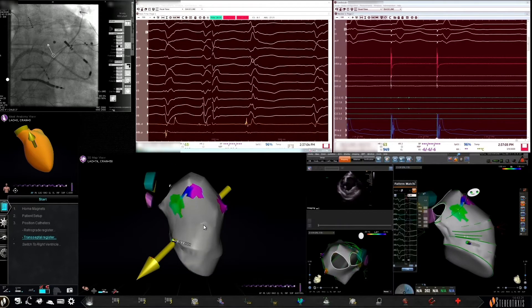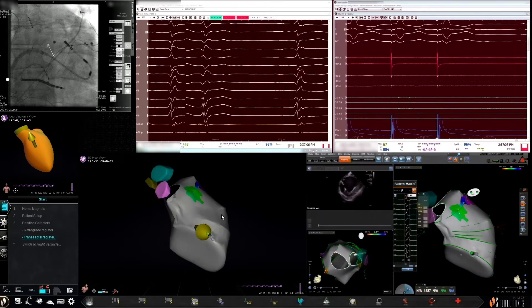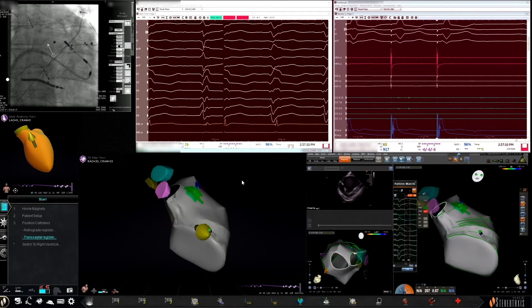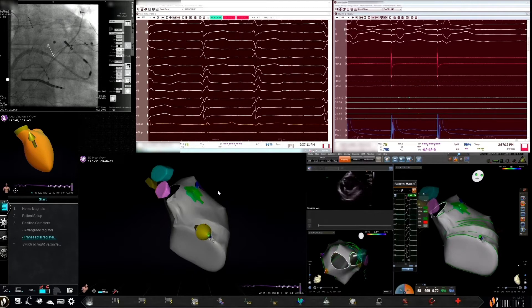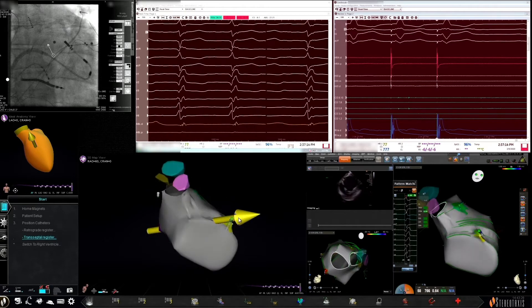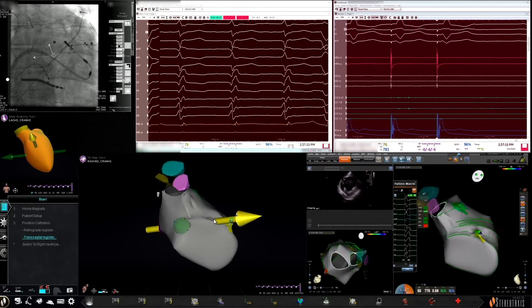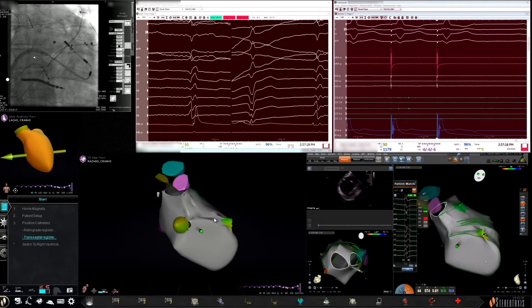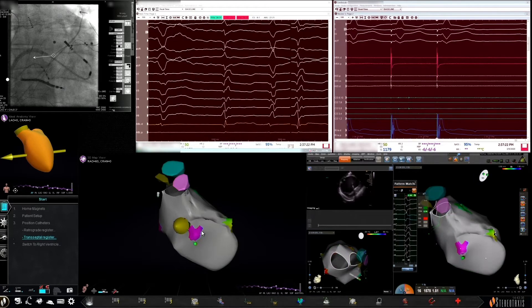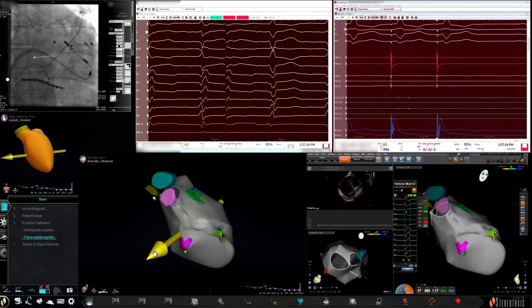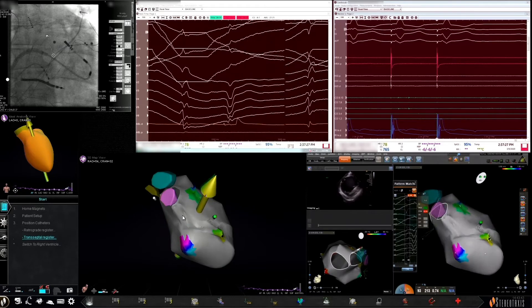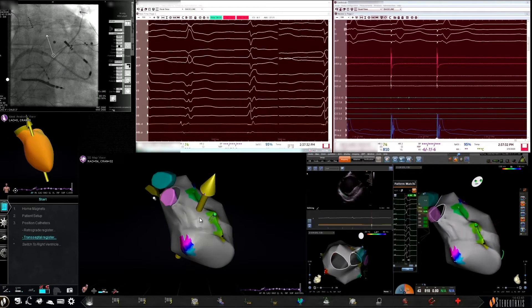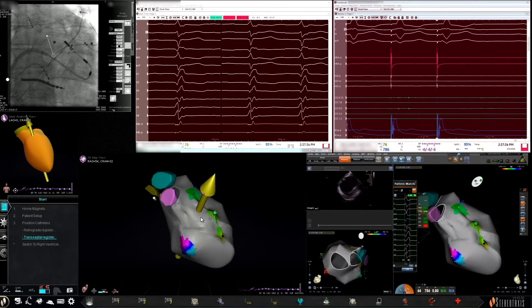Once the ablation catheter was placed into the left ventricle and magnets were brought in, mapping was performed to grossly identify areas of scar. With 5mm settings used to move the catheter quickly to different geographic areas of the left ventricle — starting on the lateral wall and then moving to each individual location to identify potential substrate — with approximately 10 to 15 points performed, this entire process from when the magnets were brought in to completion of a general map was approximately 8 minutes.